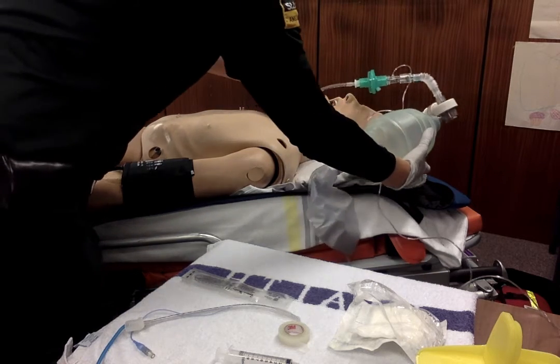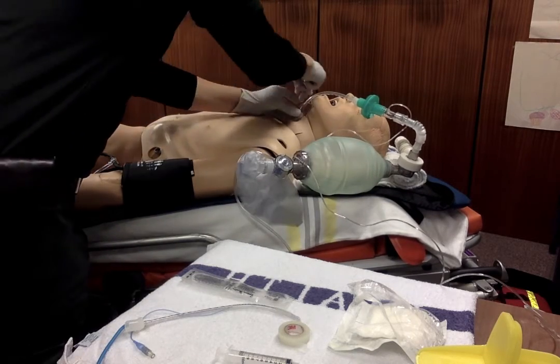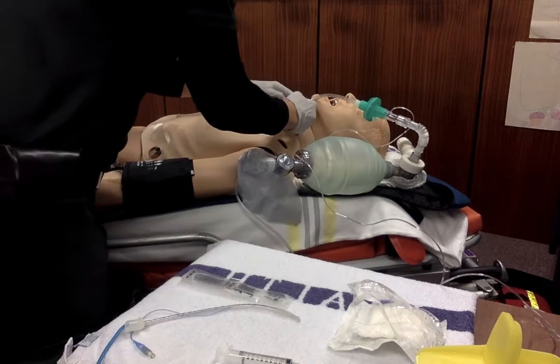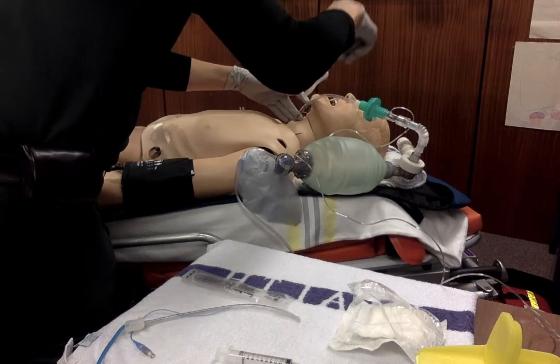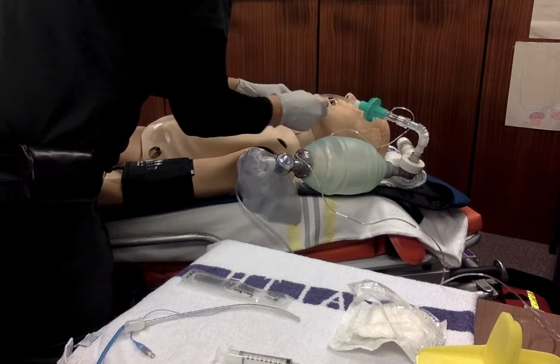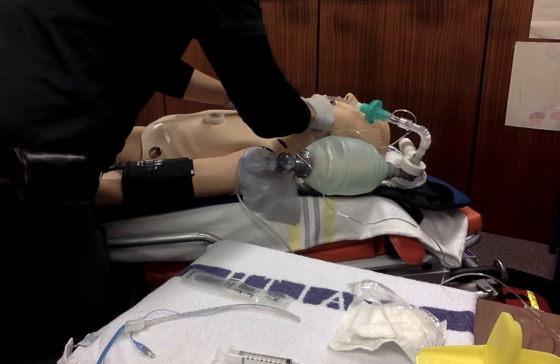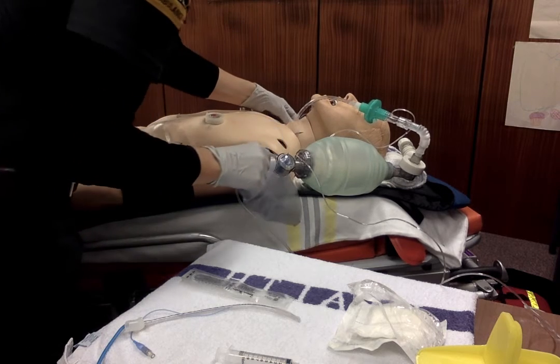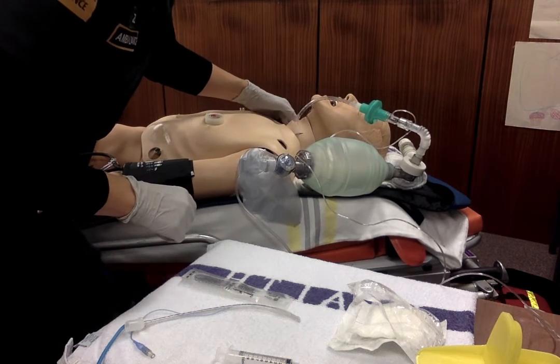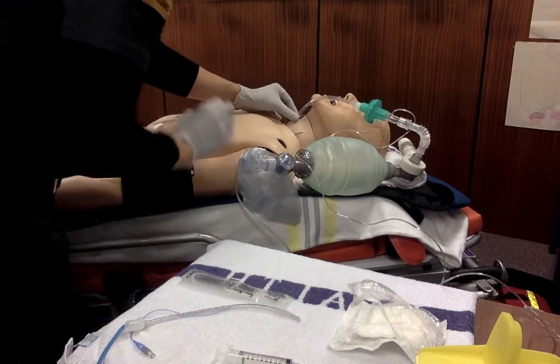Once I'm happy initially that I've got it in a good spot, I want to try and secure it. So I'm going to do a quick bit of tape just to give it an initial securing. Whichever you use, you want to make sure you don't have it too tight that you are cutting off blood flow up to the brain.